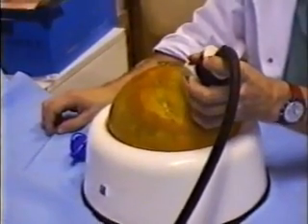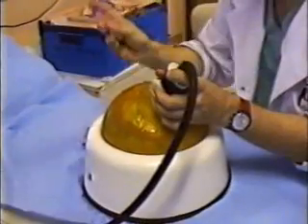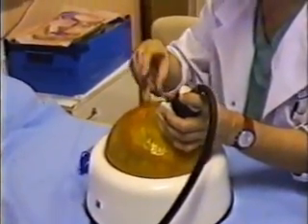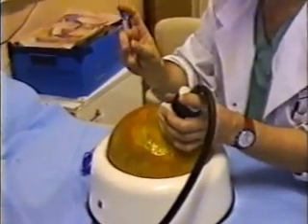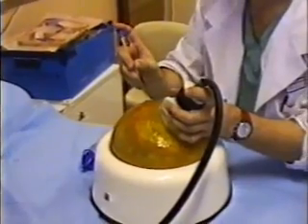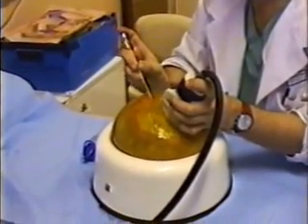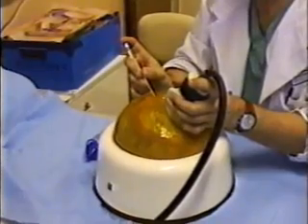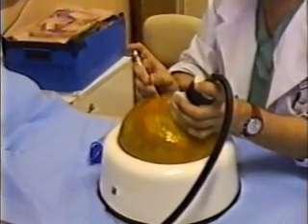The objective of this procedure is to withdraw blood from the foetal cord. Using the transducer, the trainee images the foetal cord. He taps the surface of the abdomen where he intends to insert the needle. Watching the screen, the needle passes through the uterine wall and into the amniotic sac, reaching the foetal cord.